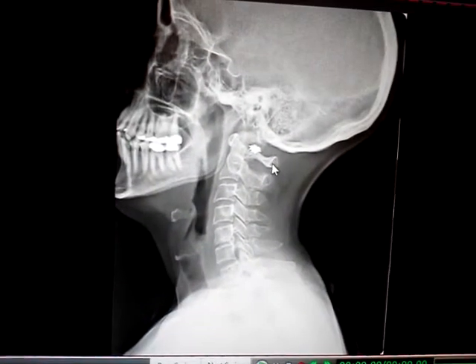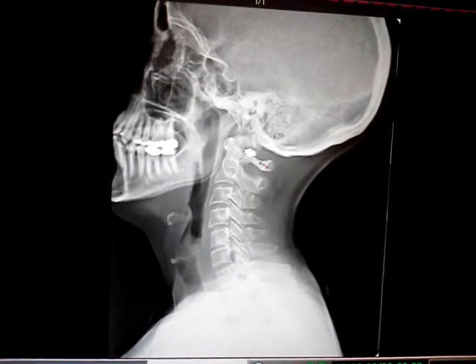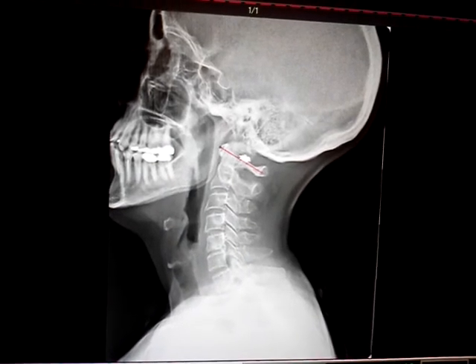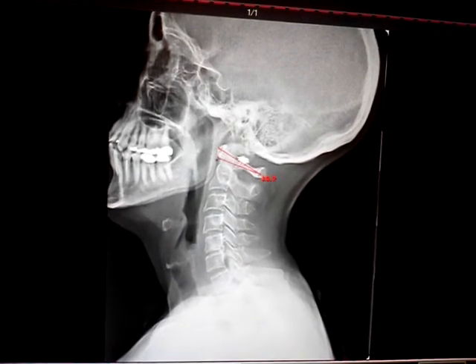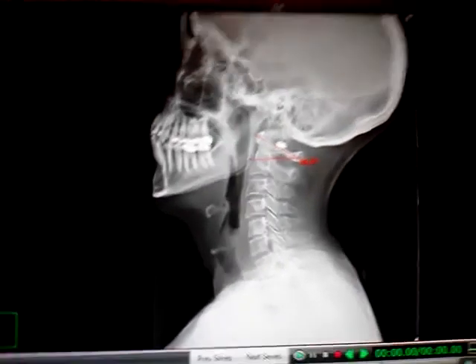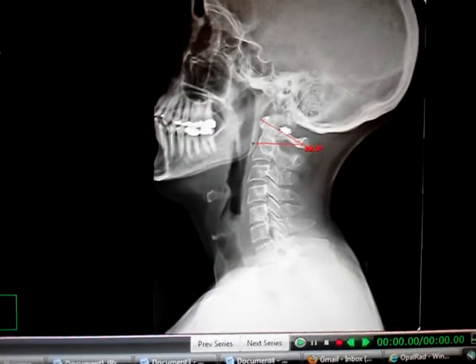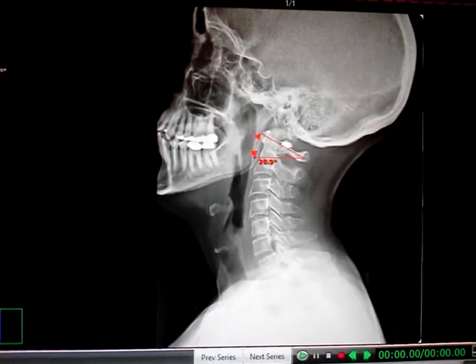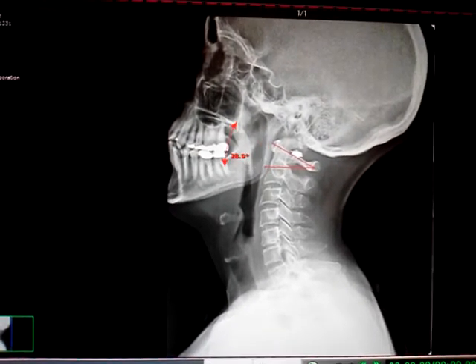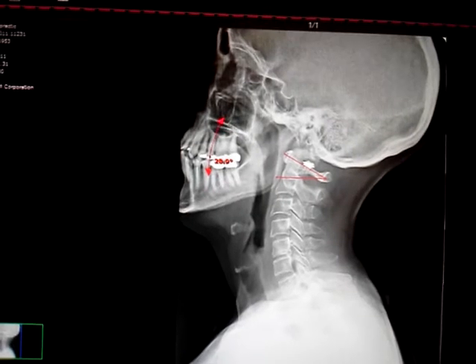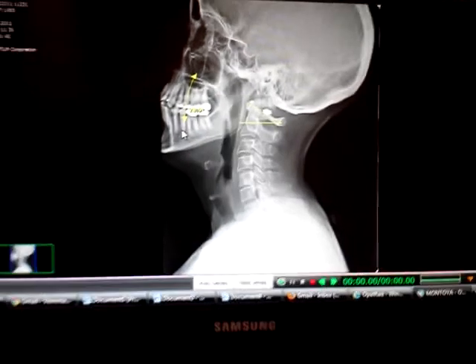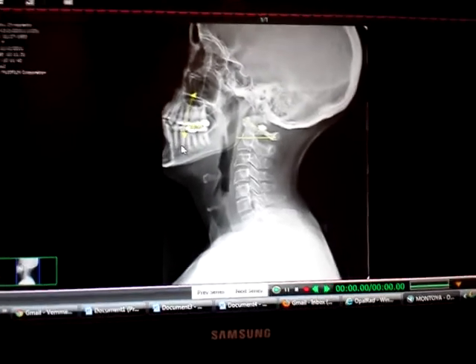Click on the posterior element of C1 right here. Go to the front of it and click on the front. Come down, and you'll be able to see the line is perfectly straight — it'll have a kink in it if it's not. Then you just extend out to the left, and in this case it's a 29-degree APL line.